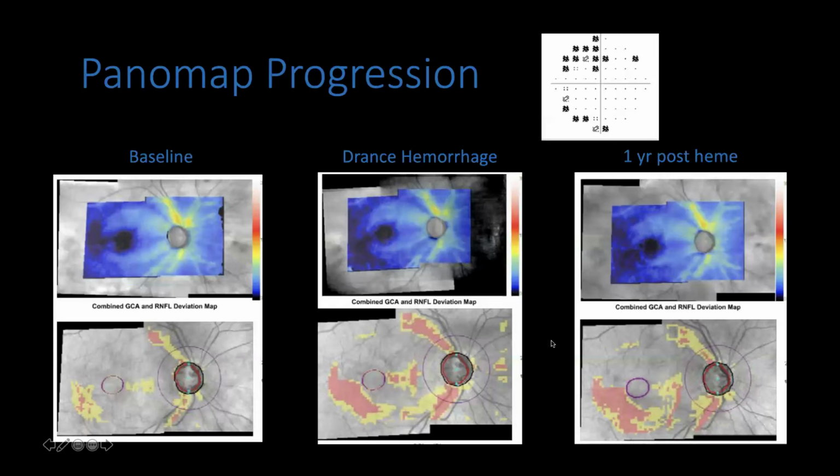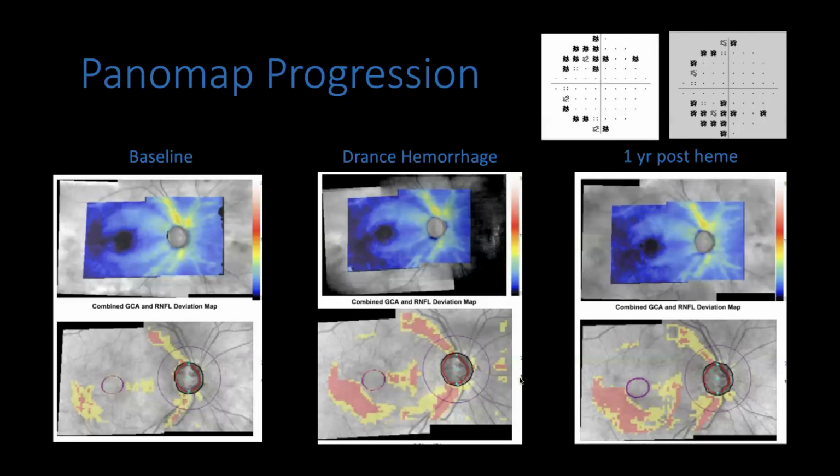And this is the visual field defect representing the change. But if you look at the mirror image of that, you notice that it actually overlaps the deepened area of the defect in the ganglion cell layer.